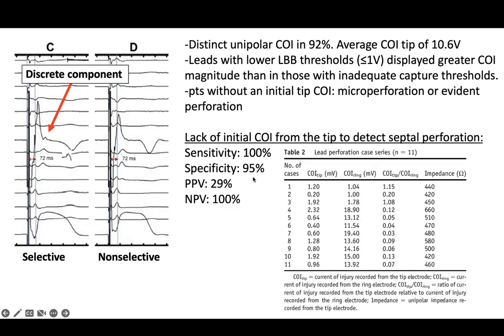So how do you decide you have microperforation? I mean, you're just making this up, I think. Well, okay, let's keep going. It's a good question. I think Vartan has a really nice case later on, so we'll have more discussion on it, because microperforation, I think, is probably the hardest to really diagnose.